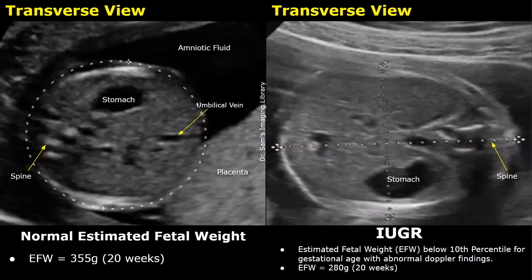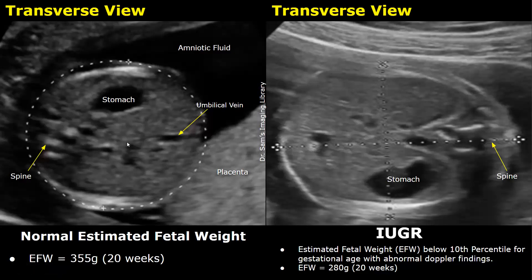Another feature of IUGR is an estimated fetal weight below the 10th percentile for gestational age, with abnormal Doppler findings. Estimated fetal weight is a collective measurement of biometric parameters, so we can refer to it instead of looking at biometric parameters individually. The normal EFW at 20 weeks is around 355 grams; in an IUGR fetus, the fetal weight in this case was 280 grams at 20 weeks, which is less than the 10th percentile and suggests growth restriction.